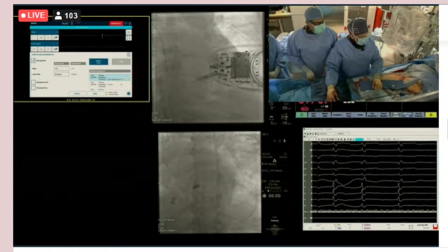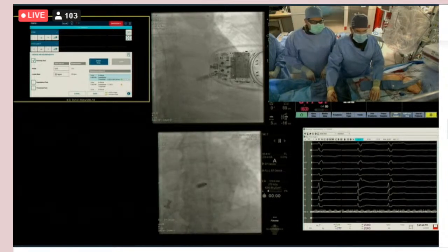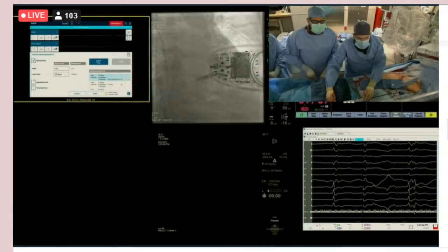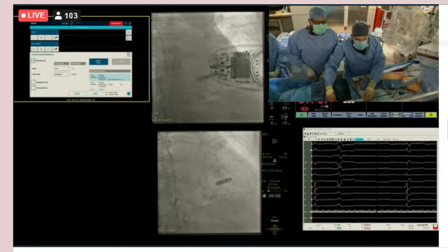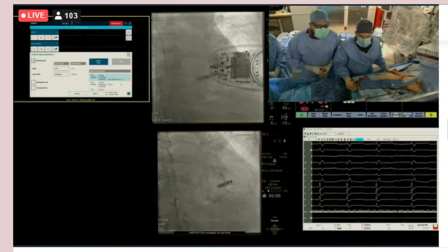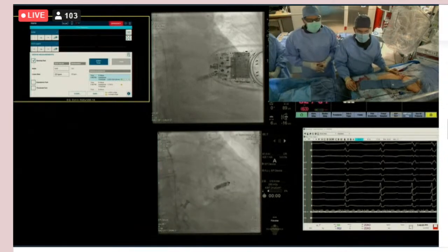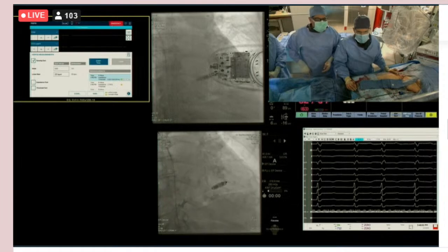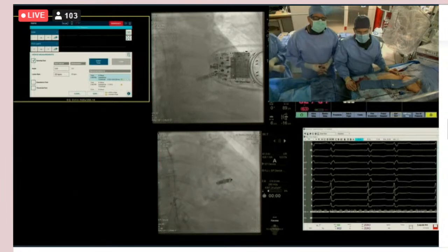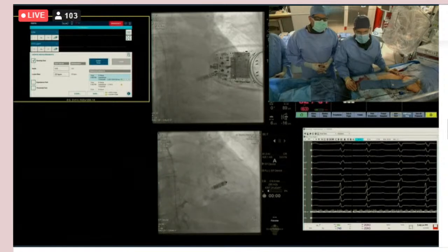And what's the pacing impedance? Can you guys from Medtronic show us the pacing impedance? Maybe if it's possible to mag on it a little bit, just so we can. Let's do that. Should I do it one more time? Well, no, if you're comfortable with it, I'm okay with it, but we can't see it very well. I want everyone to see it. Sometimes magging may be a little bit. We're definitely seeing 2, maybe 3. I'm seeing 3. I'm seeing the 2 top ones and the bottom one.